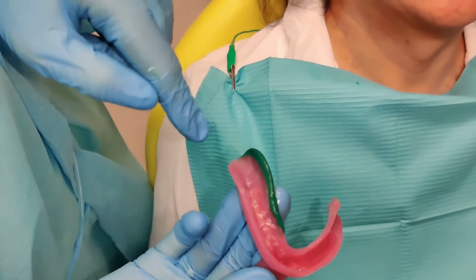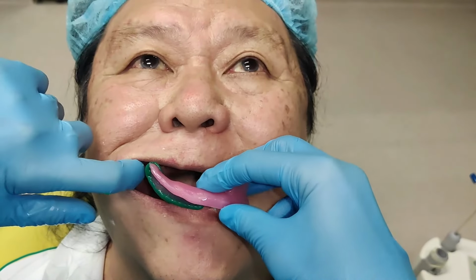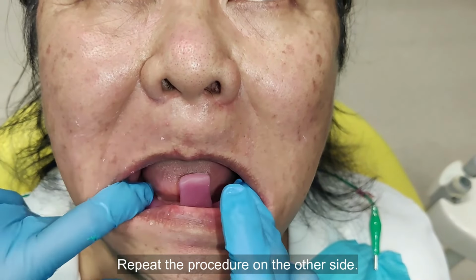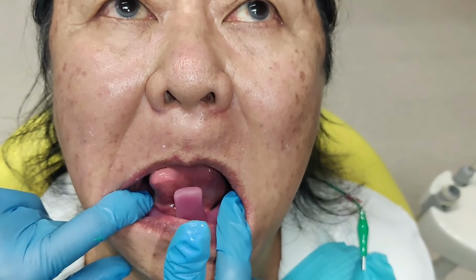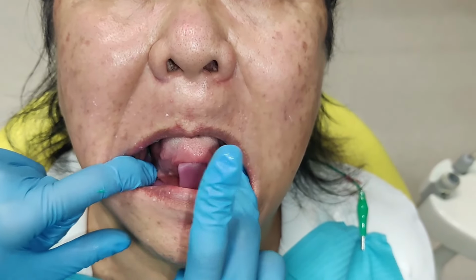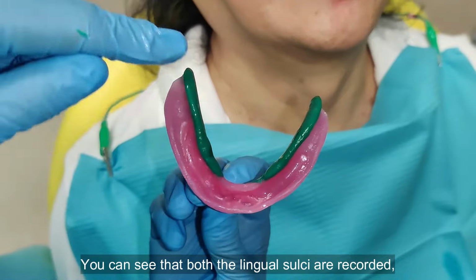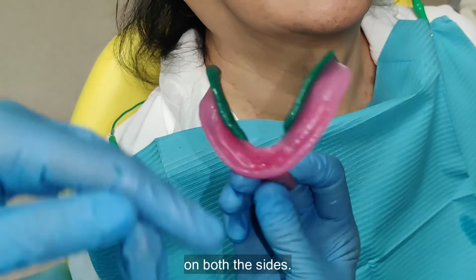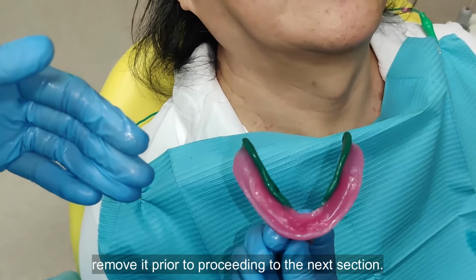You can see here the lingual sulcus of the mandibular arch, the S-shaped curve which is recorded. Repeat the procedure on the other side. You can see that both the lingual sulci are recorded. You can see the contour of the lingual sulcus on both the sides. If any material flows into the tray, remove it prior to proceeding to the next section.